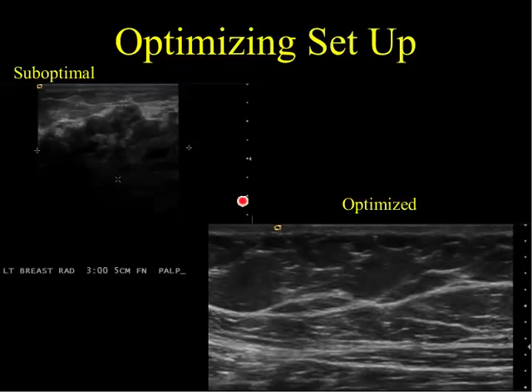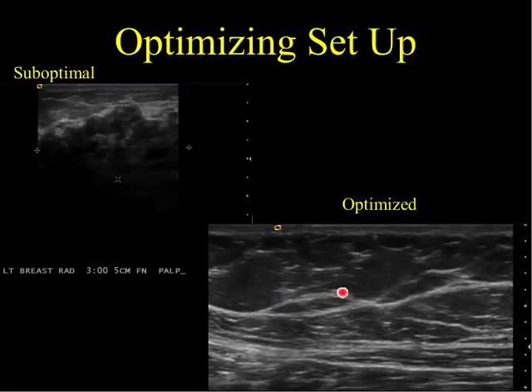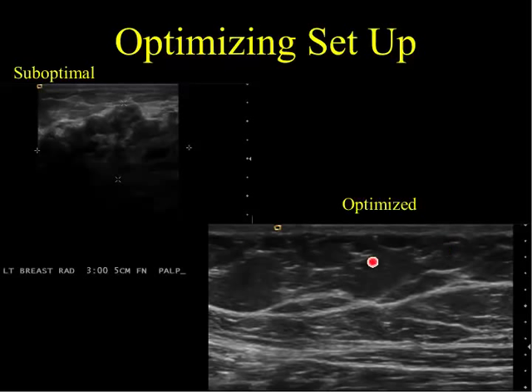The image to your right is a more optimized image. Here you can see down to the laminated pectoralis muscle. We can see the skin line, and we can see fat lobules and echogenic septa within the breast. Because the focal zone is placed posteriorly, the grayscale is a little altered in the near field. If the focal zone were placed more superficially, those echoes would brighten up a little bit, but that's about the setting that you want.